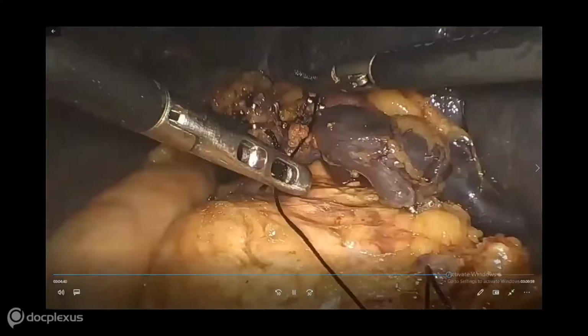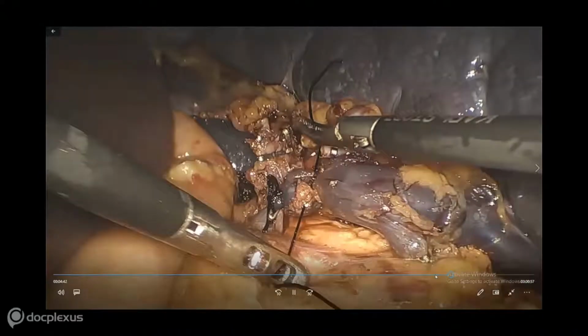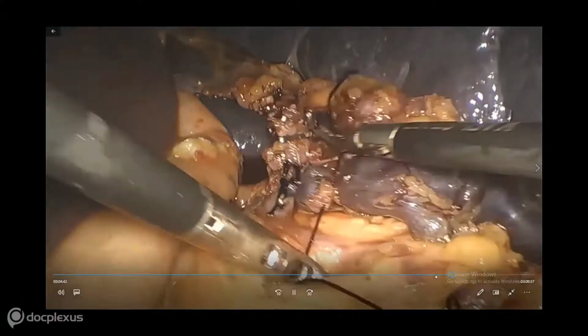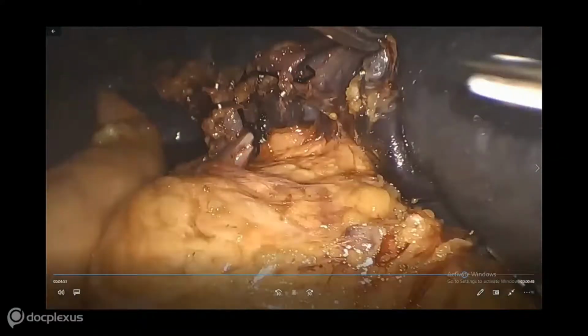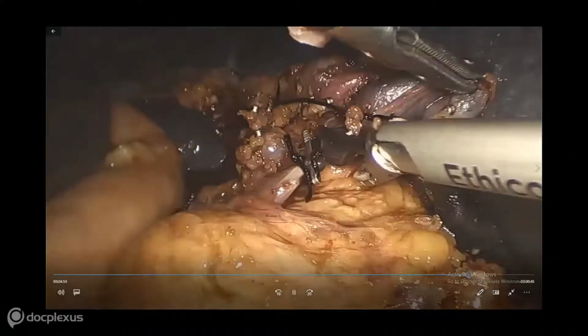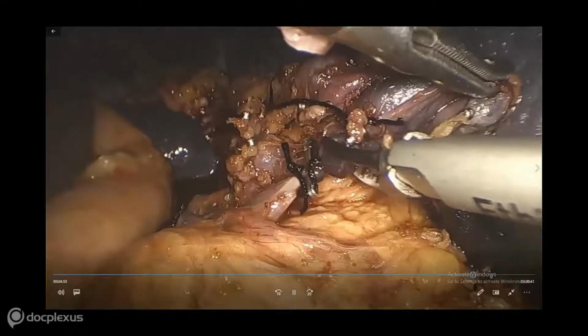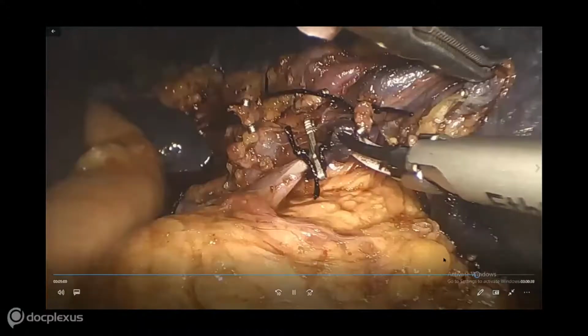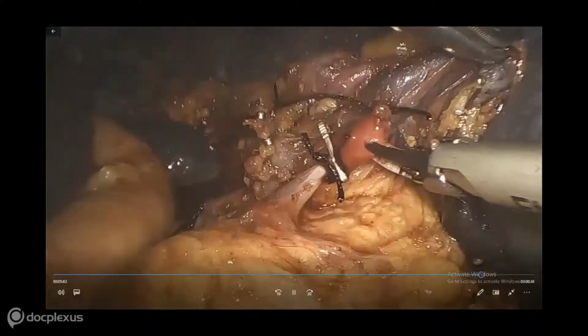Finally, if the spleen is large, sometimes we use a Pfannenstiel incision. If it is a medium sized or small spleen, you can appreciate the pancreas very close to the splenic vein. That pancreas needs to be protected, and once it is, then we will remove the spleen. In this case we remove it using a Pfannenstiel incision.